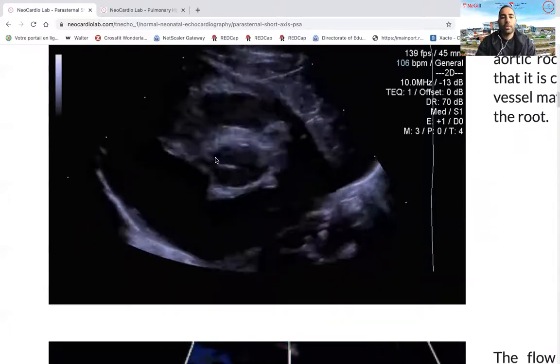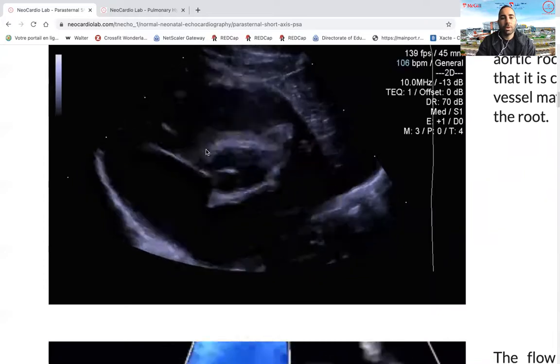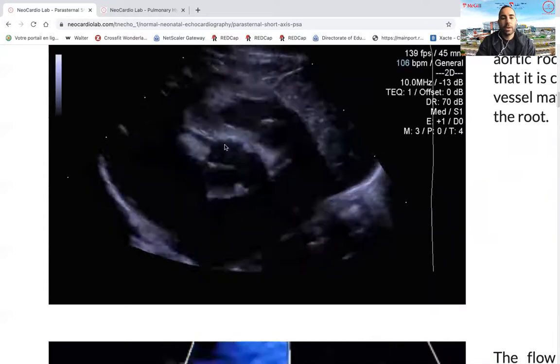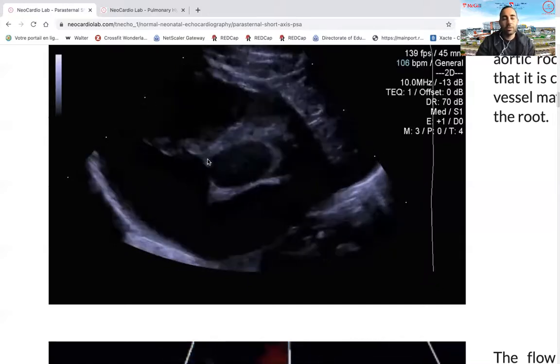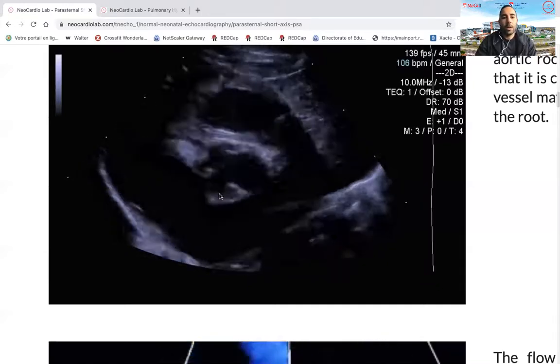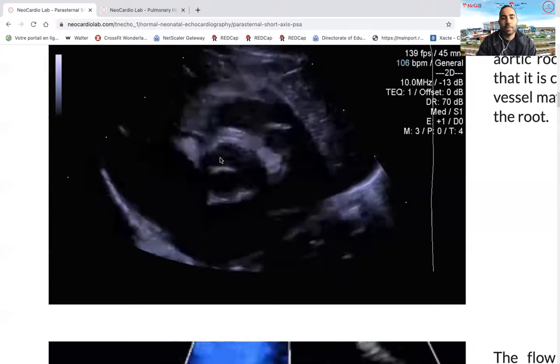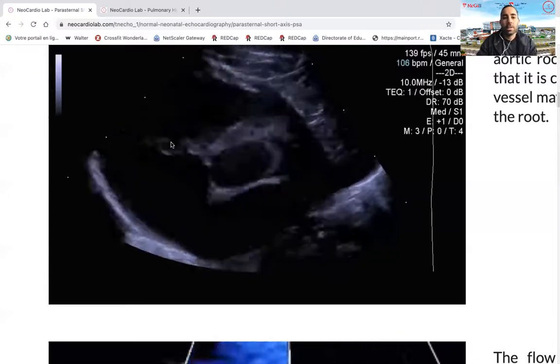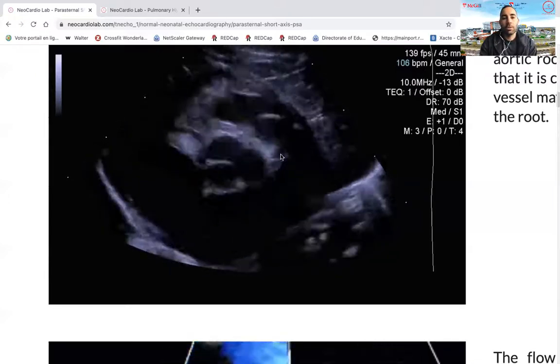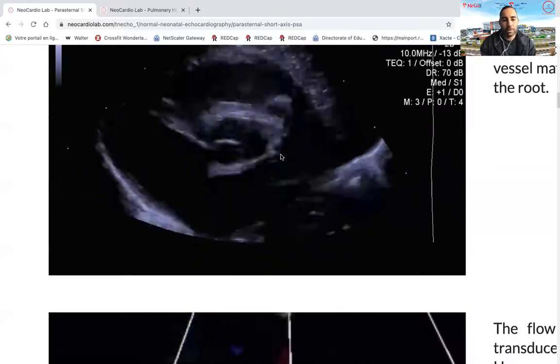So this is a clip outlining the implantation of the RCA, the right coronary artery, into the right coronary cusp area of the aortic valve. And so it's important to really see the actual artery and its implantation inside the area of the aorta, because you may have some pericardial folds that look like a coronary artery and are not.